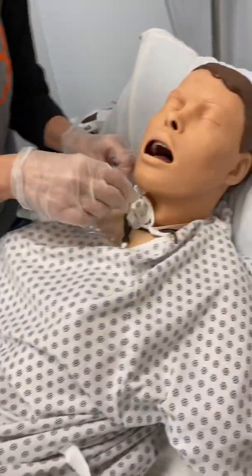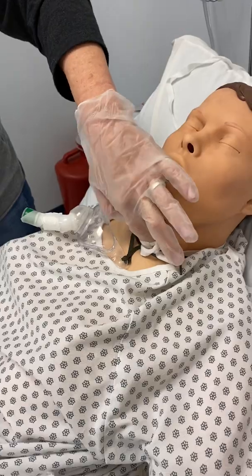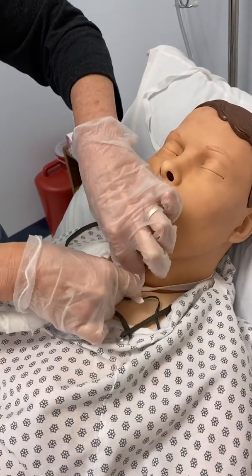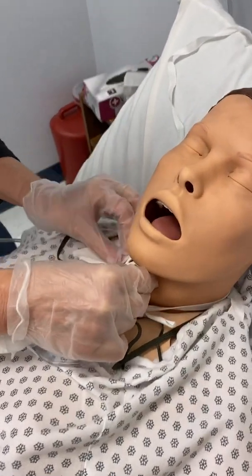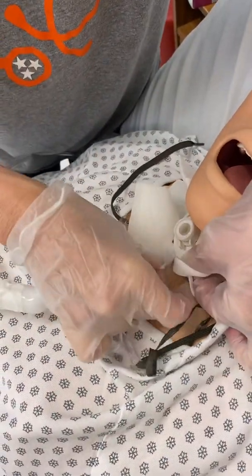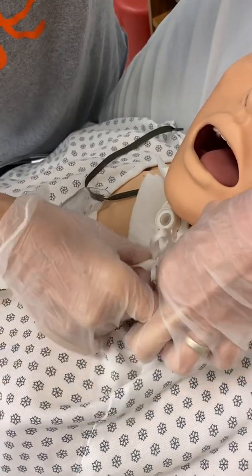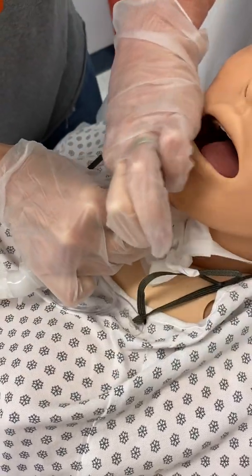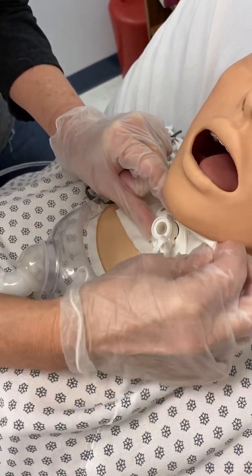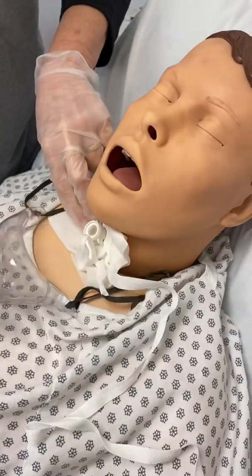Then I want to untie one of these. Again, hold on to it because that string is all that is holding it into the patient's airway. And you want to put the gauze under the neck plate. Okay. I want it to be as flat as possible. Bring the string around.